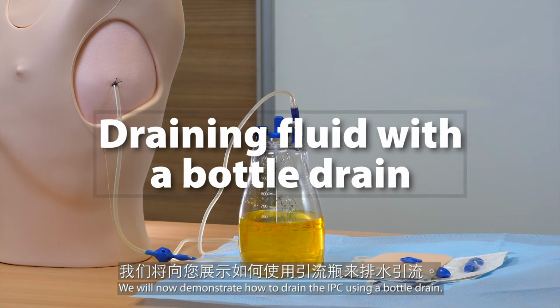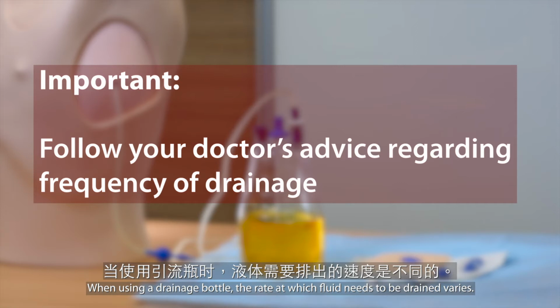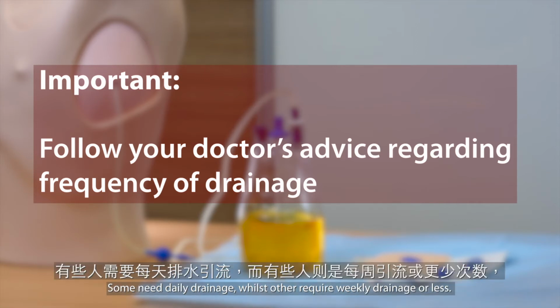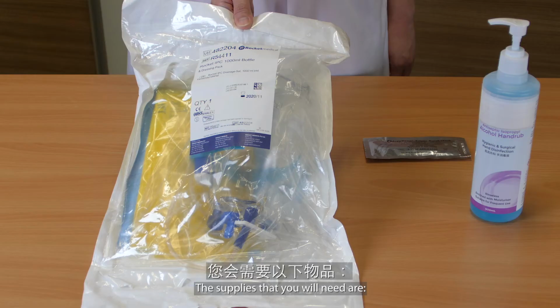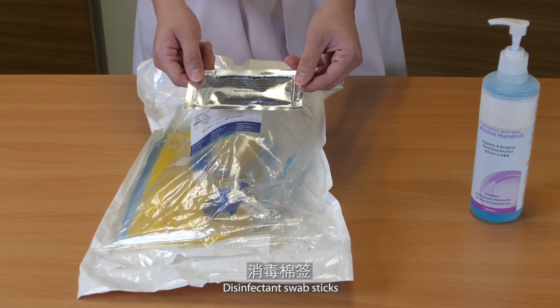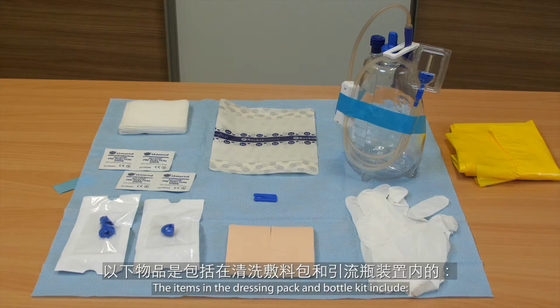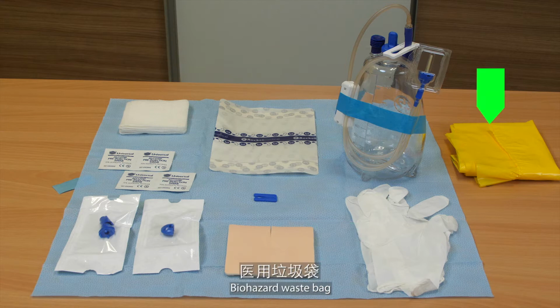We will now demonstrate how to drain the IPC using a bottle drain. When using a drainage bottle, the rate at which fluid needs to be drained varies. Some need daily drainage, whilst others require weekly drainage or less. Please follow your doctor's advice regarding the frequency of drainage. The supplies that you will need are dressing pack and bottle kit, disinfectant swab sticks, and alcohol-based hand sanitizer. The items in the dressing pack and bottle kit include pre-vacuumed bottle, valve cap pack, adapter pack, blue clamp, alcohol swabs, gauze, sterile gloves, foam dressing, transparent dressing, and biohazard waste bag.